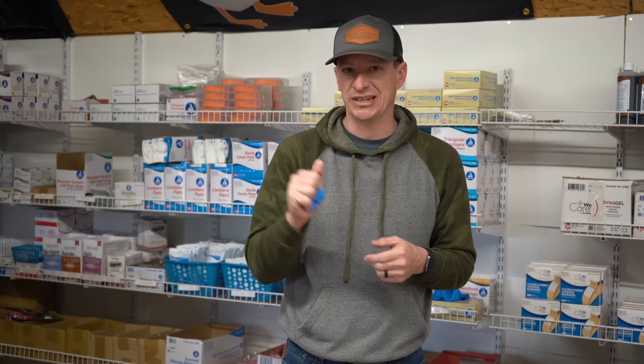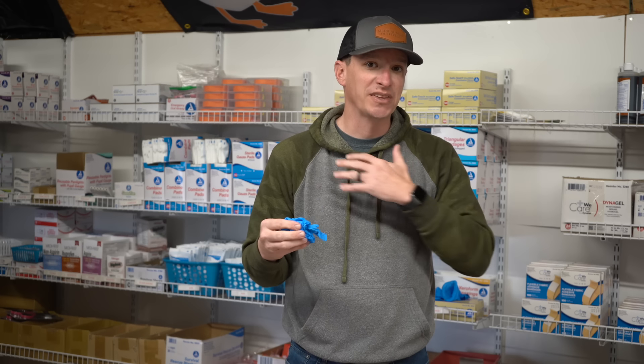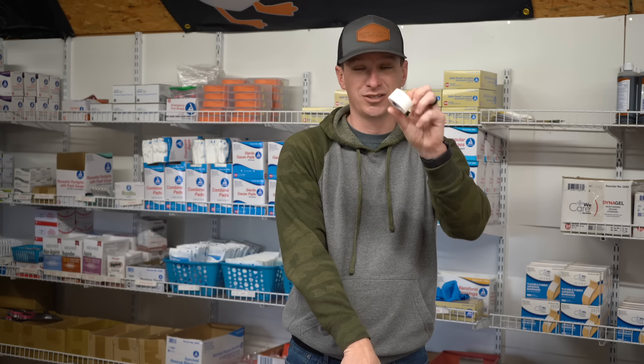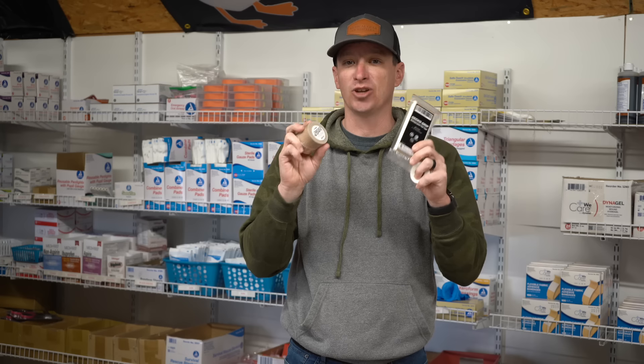A few more items — kind of a catch-all for everything else in the ultimate first aid kit, in no particular order. You're going to need multiple pairs of gloves. We've gotten away from black gloves to a brighter color so we can see blood on them — blood is difficult to see on black gloves. When you're doing your sweep to find what's wrong with the patient, you can see blood on your gloves. I also like having tape in my kit — duct tape, gecko tape, or regular cloth medical tape — this comes in handy so many times.